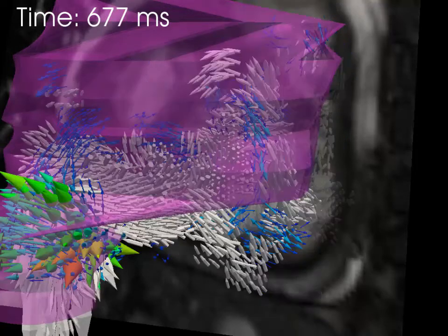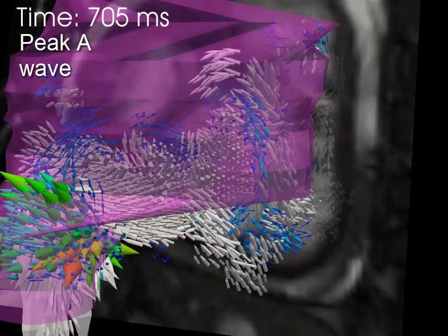Atrial contraction brings much stronger flow and vorticity. In particular, note the strong regurgitant flow back down the inferior vena cava.